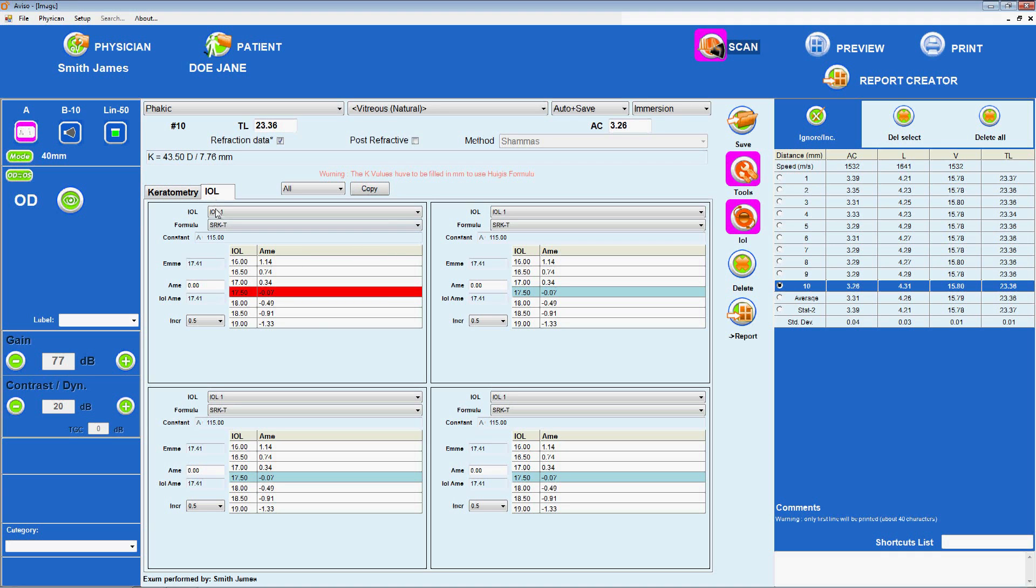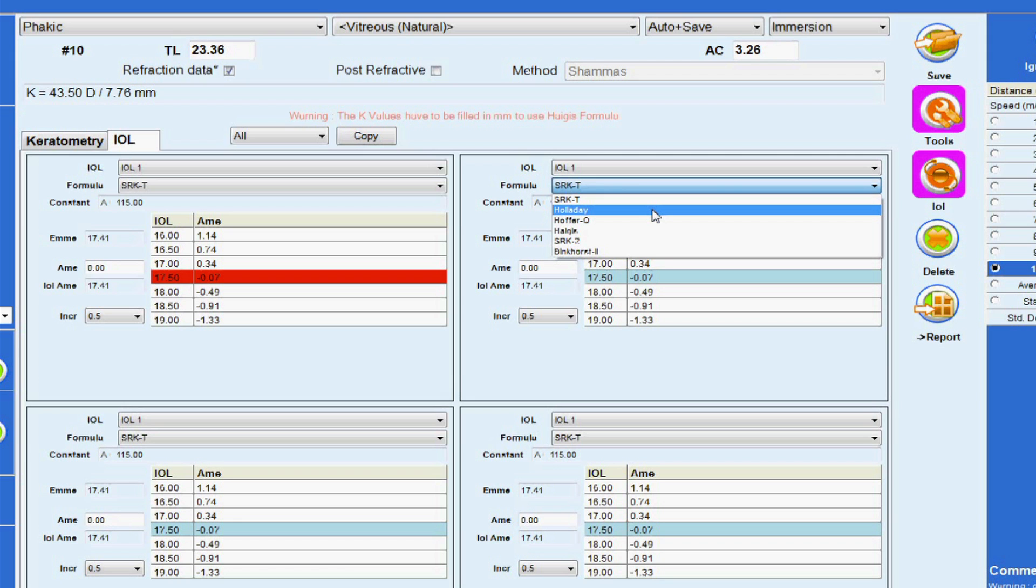Selecting the IOL icon opens the IOL calculation screen, where formulas can be selected from a drop-down menu.